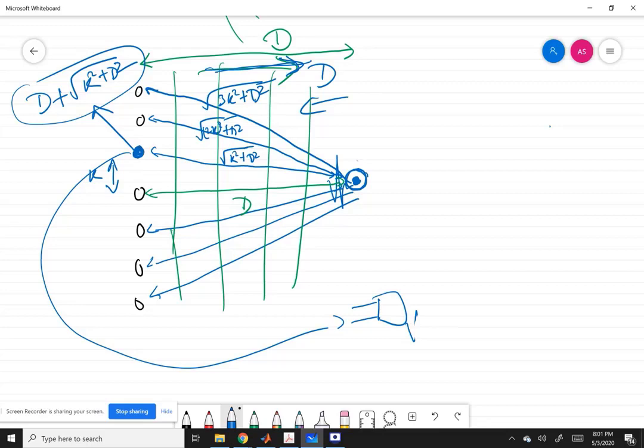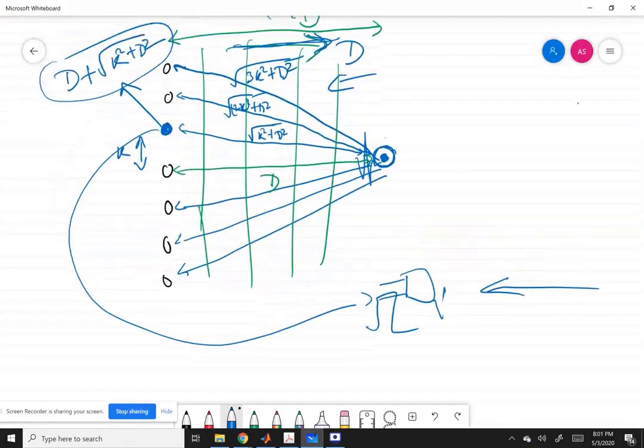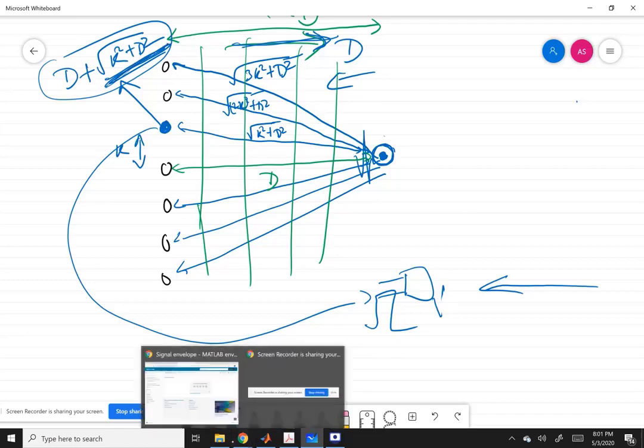Once the transducer is fired, immediately sampling starts. But the signal will arrive back to the transducer only after traveling this much space, which can be converted into time by looking at the speed of sound.